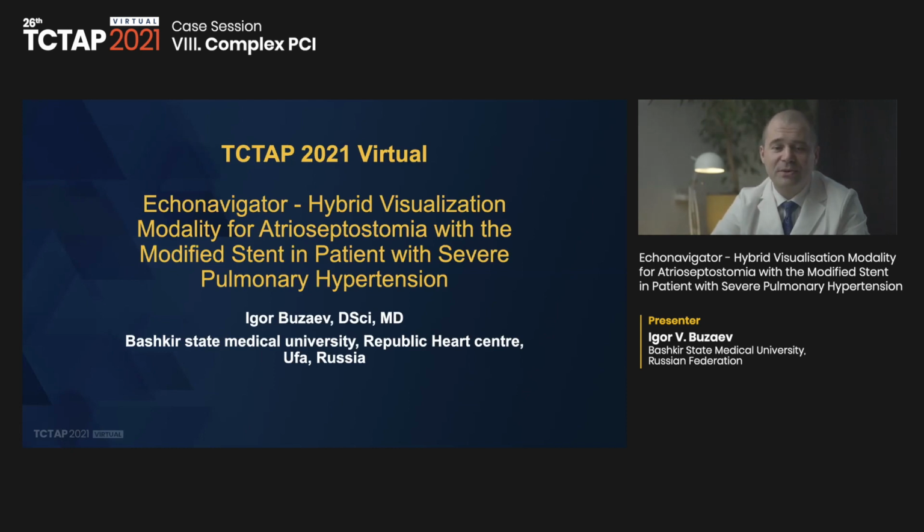Good afternoon, colleagues. The topic I want to discuss with you is about improving our eyes in the cath lab. It is about visualization. The problem is that fluoroscopy visualization is limited because it makes shadows from the X-ray positive materials and they drop the shadows on the detector. But if we need soft tissues or flows for a prolonged time without contrast, the X-ray is limited. What if we need to see more than the X-ray picture at the moment?